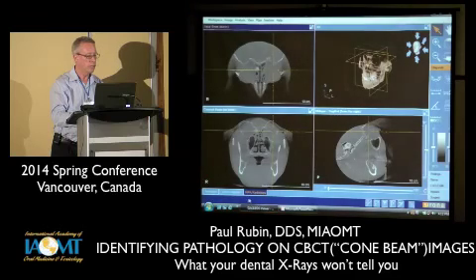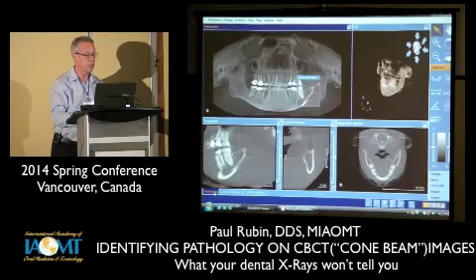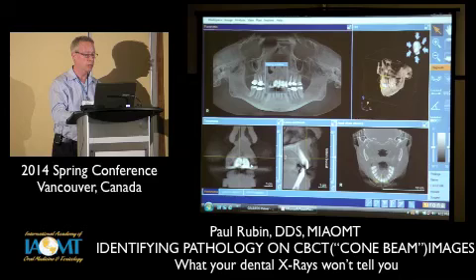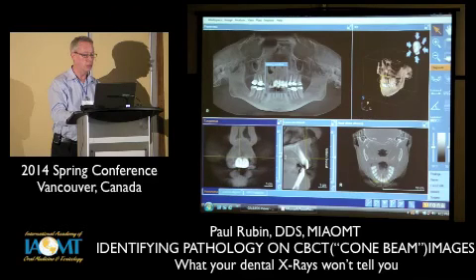Sure. He's asking about some other ways of manipulating this image. For example, if we want to look at this anterior root canal here, we'll click on the window there. This image doesn't look so great. We can see this cross-sectional view. This image is a little harder to see. You can see the little crosshairs here. I can slide and re-angle this view. Notice on the lower middle view, now I've got that lined up along the long axis of this tooth.